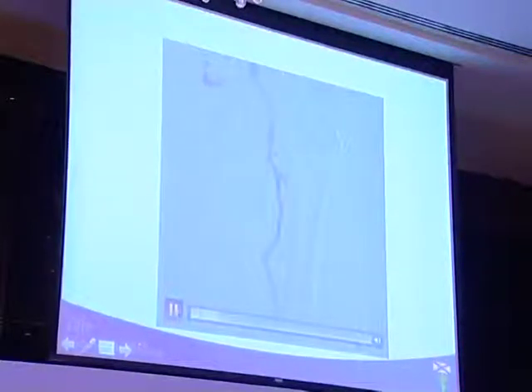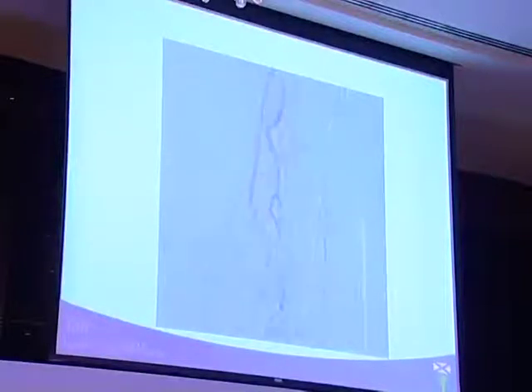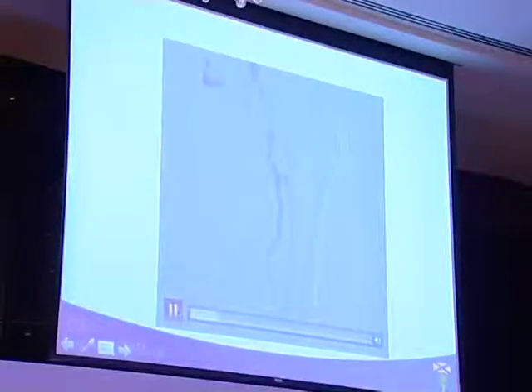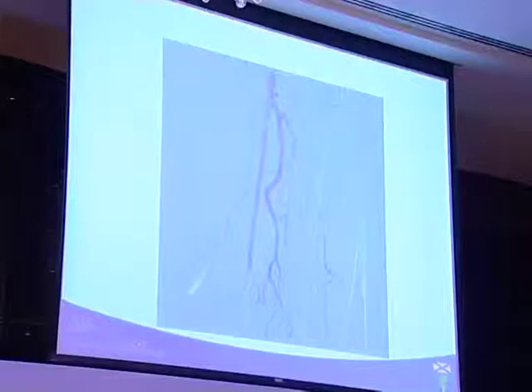So the patient is taken to the angio suite, and an angiogram is performed. I don't have all the original angiograms, but I was able to find this one, which I think is a good example of what the leg looked like. So basically, to review it, the patient has a calcified CTO in the mid to distal SFA, which reconstitutes via collaterals into a popliteal segment that is diseased as well, and has significant disease below the knee. In this case, you see that below the knee, he has an occluded PT, a diffusely diseased peroneal, and some hint of the AT.